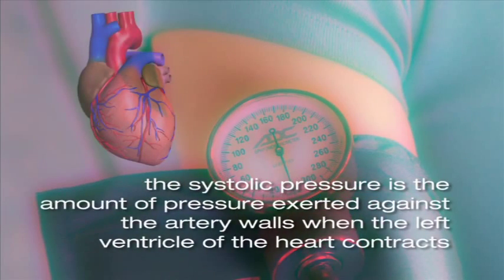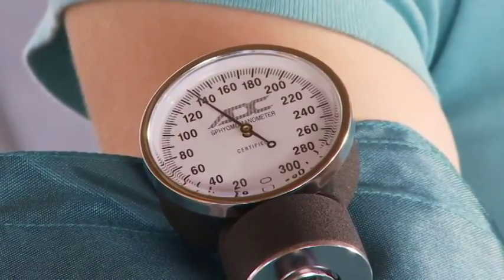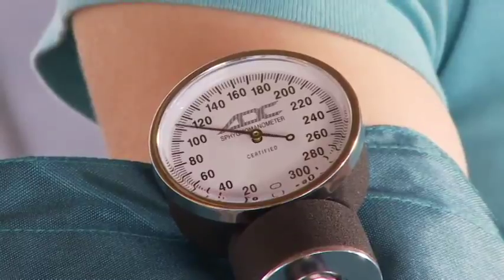The systolic pressure is the amount of pressure exerted against the artery walls when the left ventricle of the heart contracts, distributing blood throughout the body. You will record the systolic pressure when you first hear a sound through the stethoscope as you release the pressure on the blood pressure cuff.